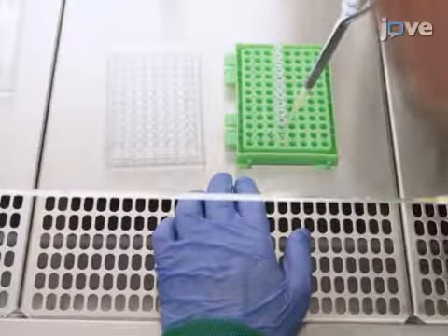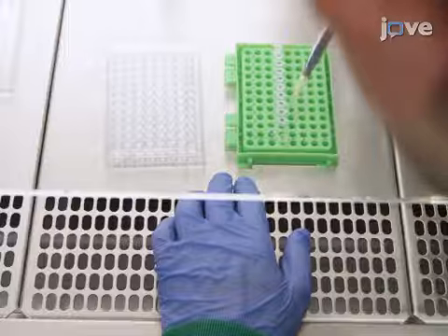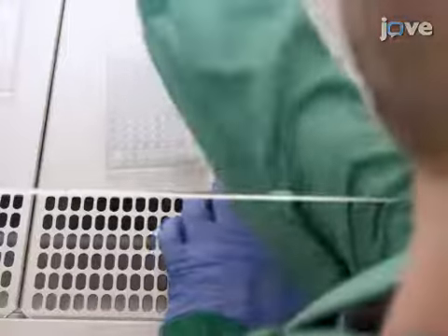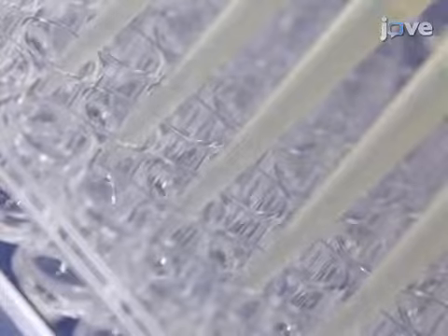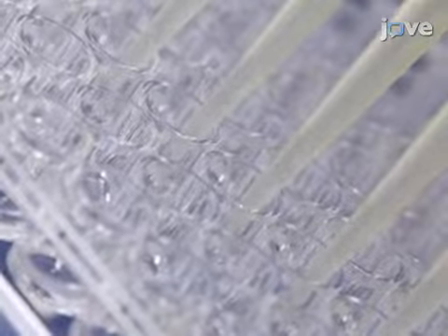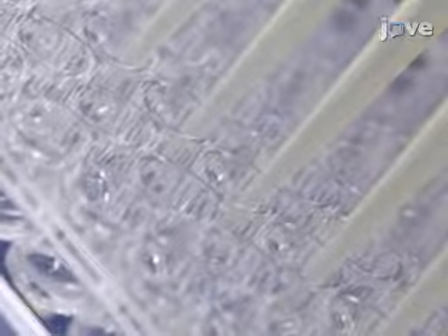Add 25 microliters of the appropriate antiserum to the first well of the 11th row as a positive control. Then transfer 25 microliters from the first well of each row to their successive wells to perform serial two-fold dilutions. Pipette up and down 10 to 15 times.